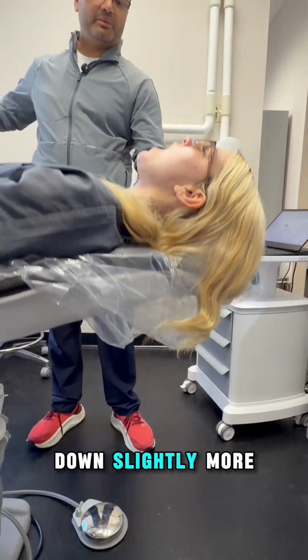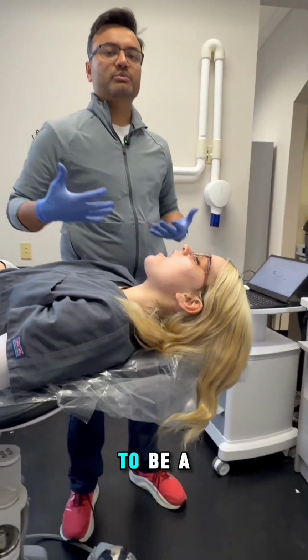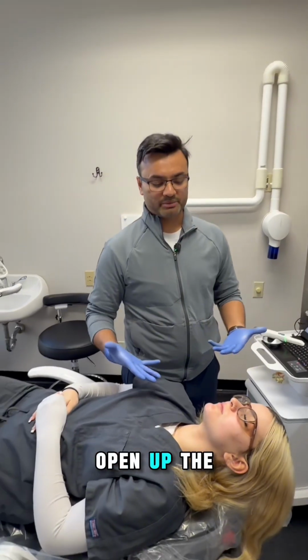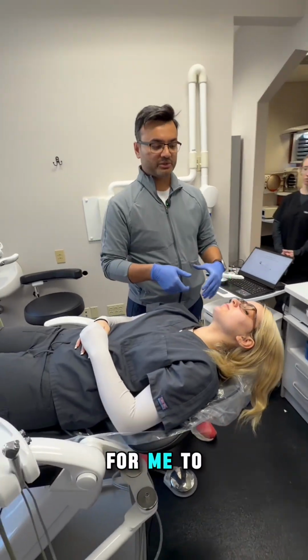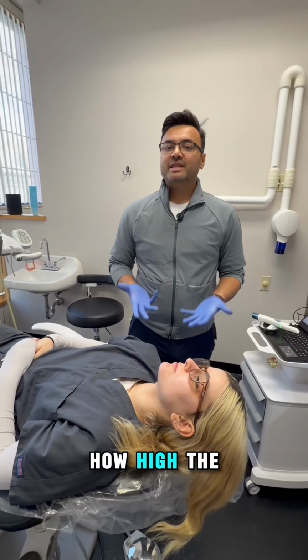Can I lean down slightly more? Yes, I can. This automatically allows the neck of the patient to be a lot more relaxed because you're leaning back. It's going to allow them to open up the mandible. So when you're working on the maxilla, this is a much better position for me to scan versus me going like this. Second thing, let's talk about how high the patient needs to be.